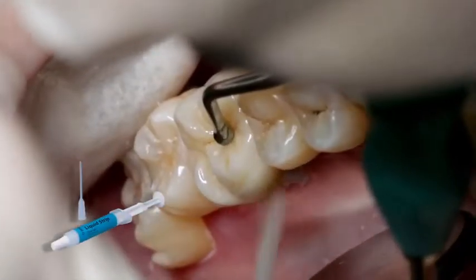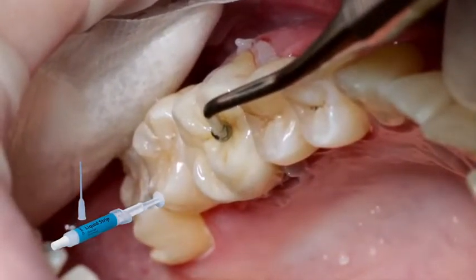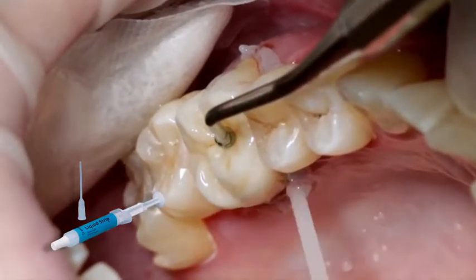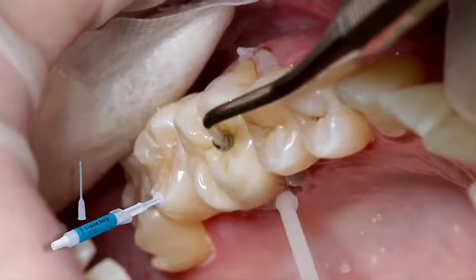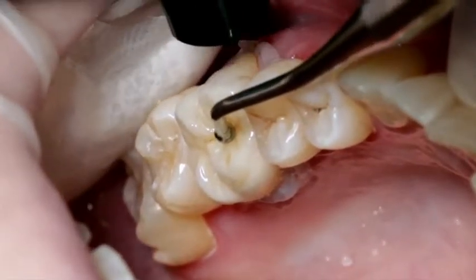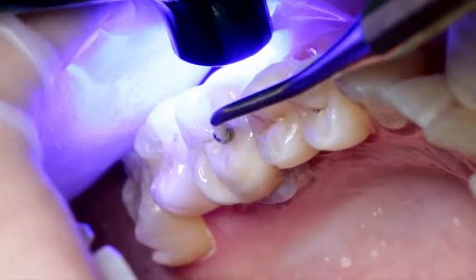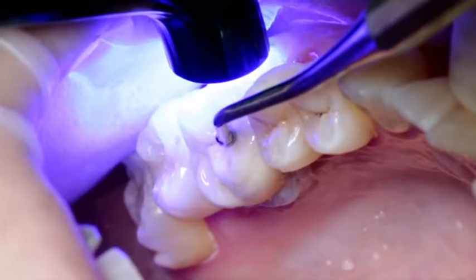Like all composites, Multilink Automix is subject to oxygen inhibition. In order to avoid this effect, cover the restoration margins with glycerin gel or air block immediately after the removal of excess cement. Liquid Strip is particularly suitable for this purpose. Subsequently, light cure all cement margins for another 20 seconds using, for example, the Bluephase Style curing light, with a light intensity of 1,100 mW per square centimeter.